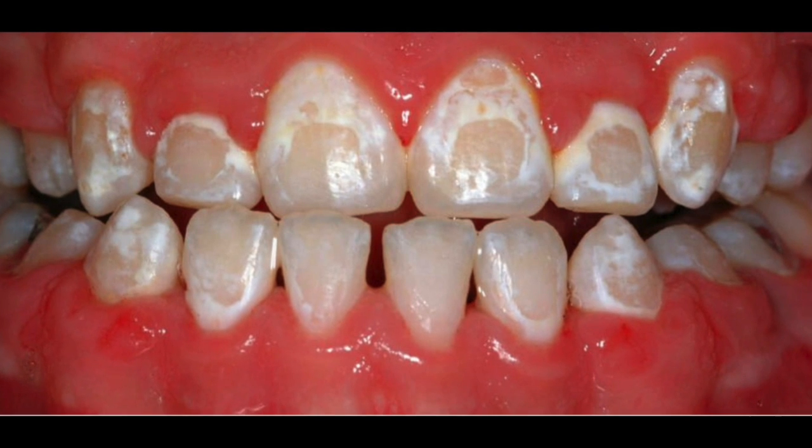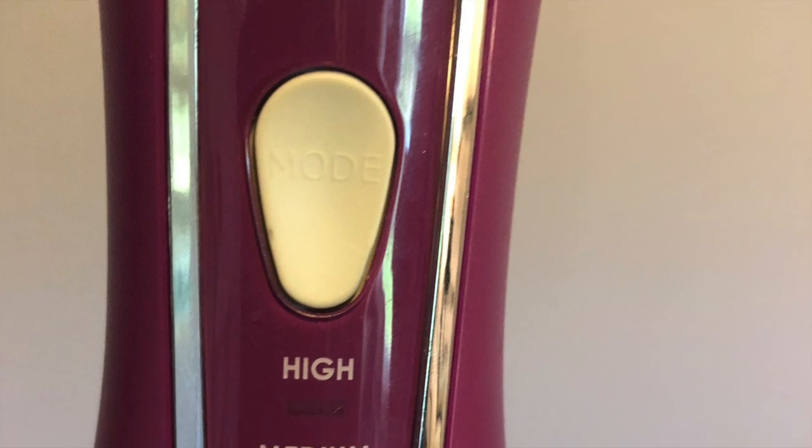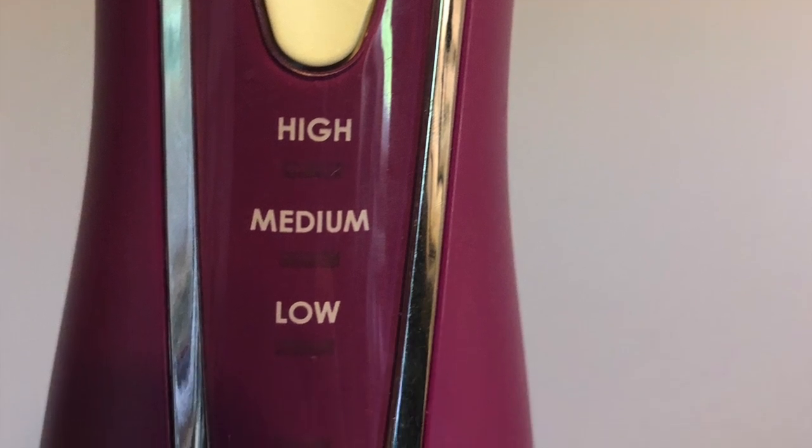The other problem from that is when that plaque accumulates with those ortho, when you take those brackets and wires off, you can have white spot lesions, which are early cavity lesions. And we want to eliminate that as much as possible. So sometimes in private practice, when I was in private practice several years ago, if I saw somebody like that come in, what I would have them do is start, and everybody should always start on the lowest speed, by the way. That's the great way to start. But just that lavage to help get them back in shape where they feel like they can brush and where they can use it.